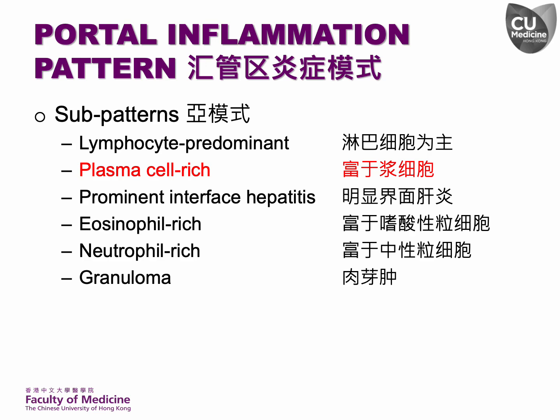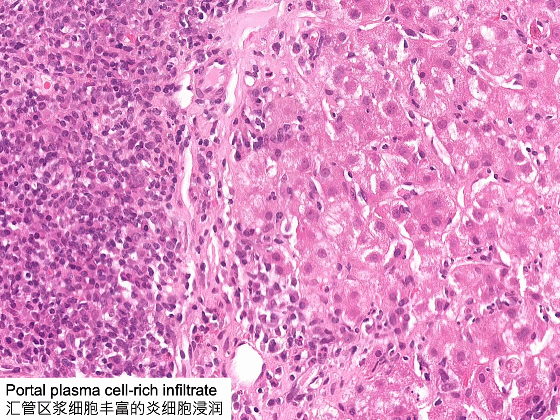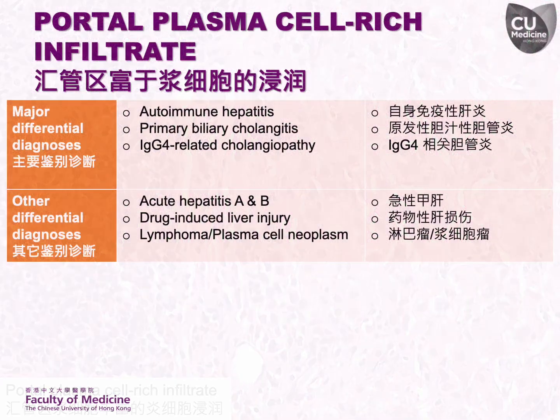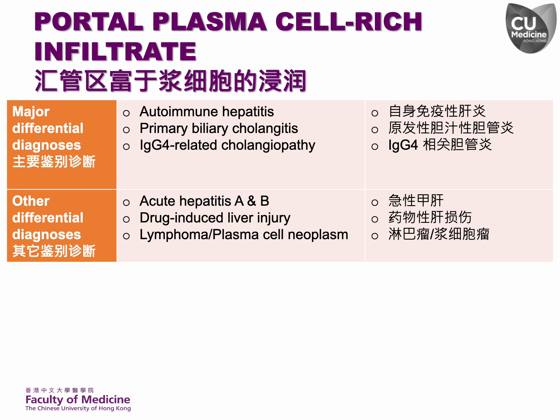The next sub-pattern is plasma cell-rich portal inflammation. This portal tract is significantly expanded by a plasma cell-rich inflammatory infiltrate. Plasma cell-rich portal inflammation is typically associated with immune-mediated liver diseases such as autoimmune hepatitis, primary biliary cholangiitis, and IgG4-related liver disease.